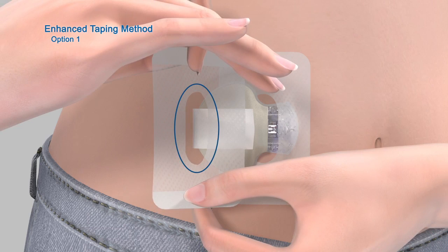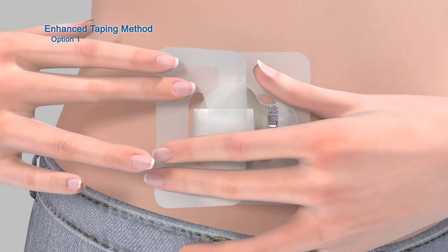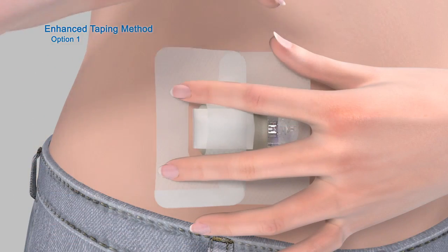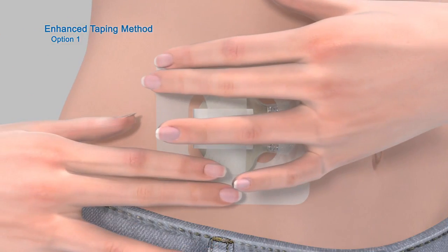The hole in the center of the tape should expose the back of the transmitter. Smooth down the tape on your skin and transmitter to reduce air pockets. Now remove the paper backing marked number 2 and press the remaining overtape against your skin.